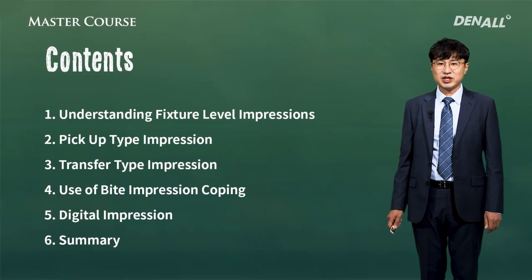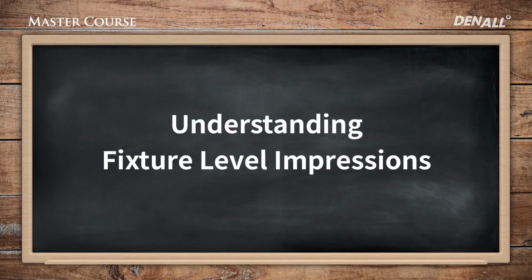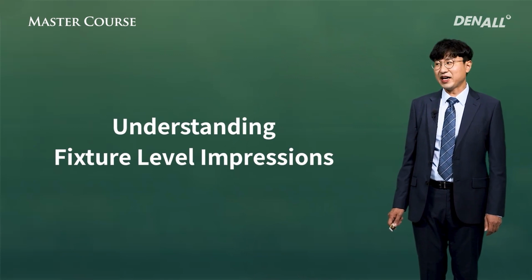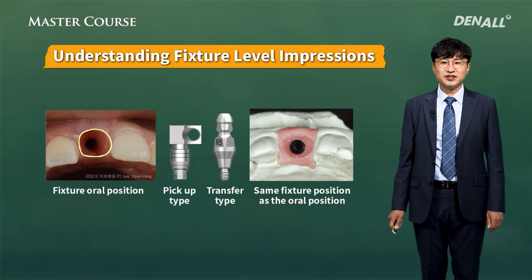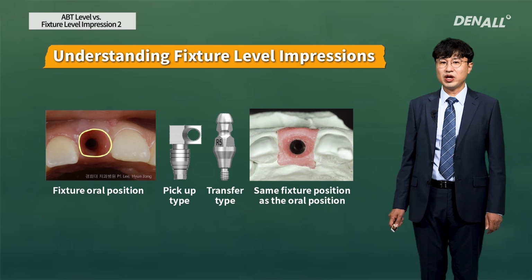So this will be the content that I'm going to talk about. First, understanding of the fixture level impressions. Fixture 3D positioning in the mouth using impression coping, you recreate using model.